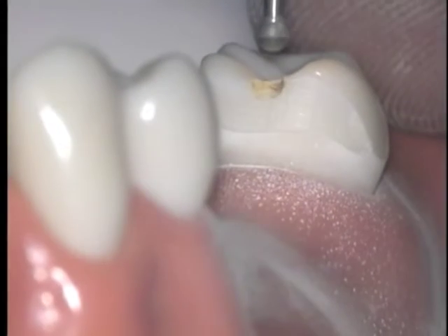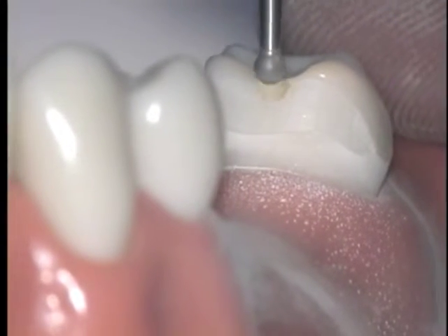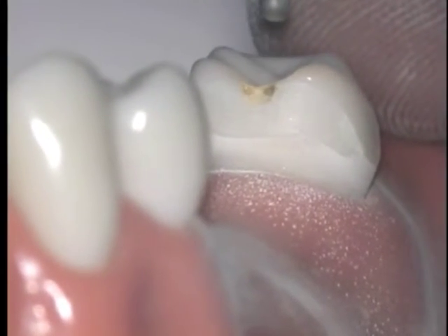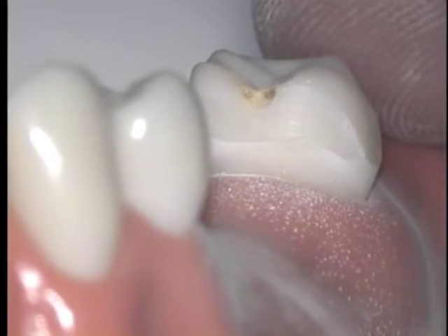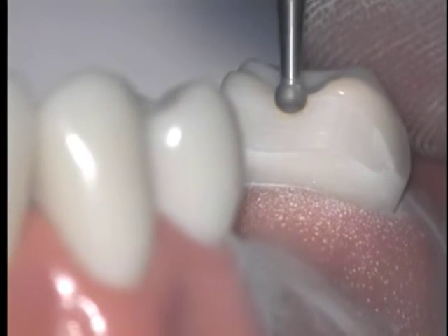We will begin this preparation without water so that you can see the outline of the preparation more clearly on the high contrast surface of the tooth. Clinically, you don't want to see any burn marks on natural teeth. Use your diamond burr cleaner to avoid this.